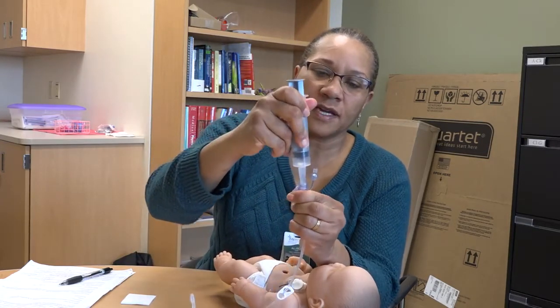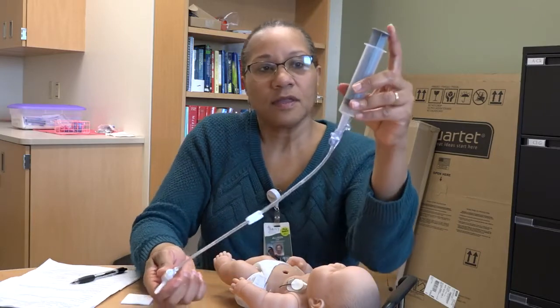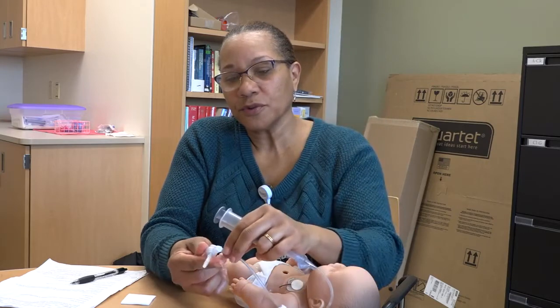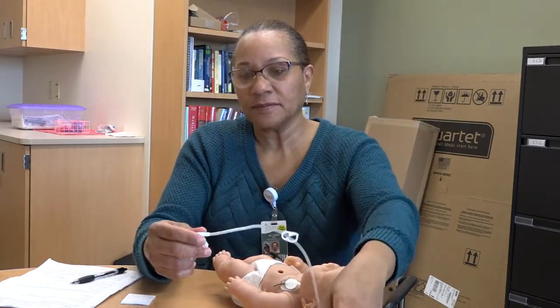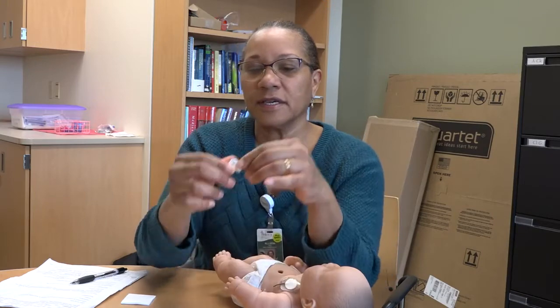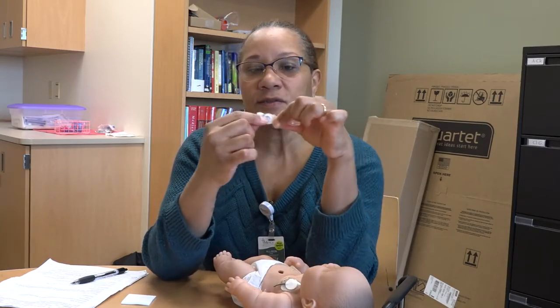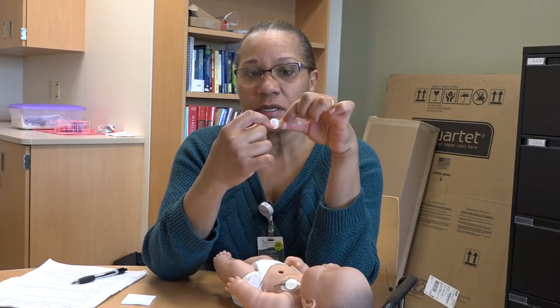We're going to attach that catheter tip in there, and this would be with water. Then you're going to instill the water, and it goes through and clears this tubing of any formula or medicine. What that does to the tube itself is it clears the anti-reflux valve that is right at the top of the inside of this feeding port.